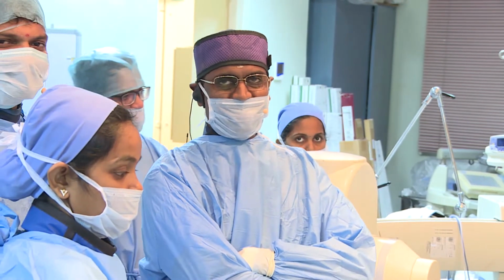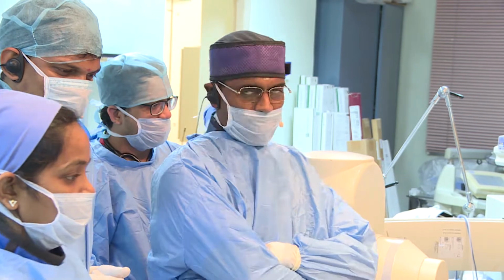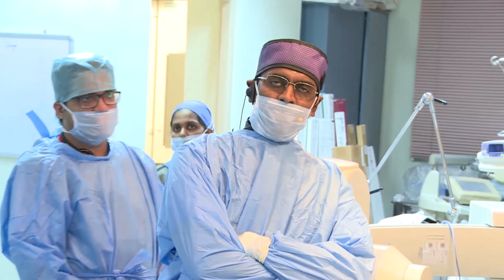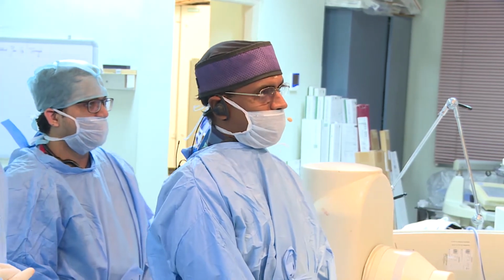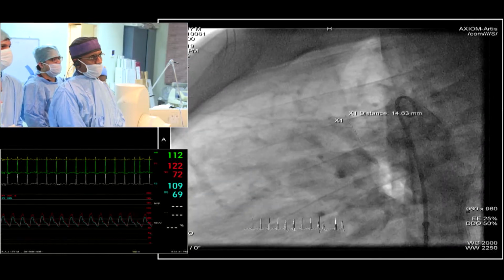So, did you perform an angiography, have you measured the duct already? I will give you the ductal angiogram, but what are the problems that we anticipate in a very large ductus? The pictures are not going to be good. Show the aortogram. So you have to do in any case a sizing of the duct.